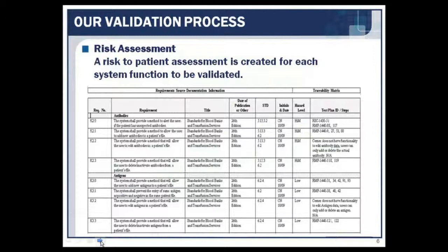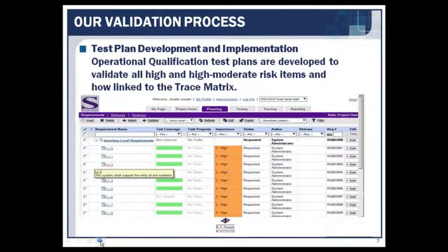Next slide. This is our traditional trace matrix. We'll still be offering this. You can see the requirements on the far left. You can see what they are. You can see where they came from under the title. And you can see on the far right which test plans actually test that script. Go right, please.